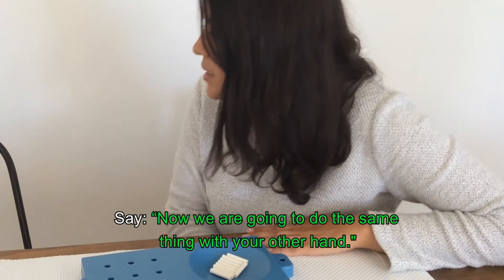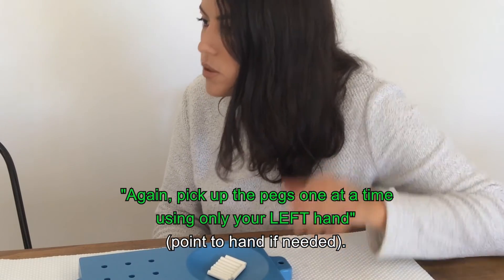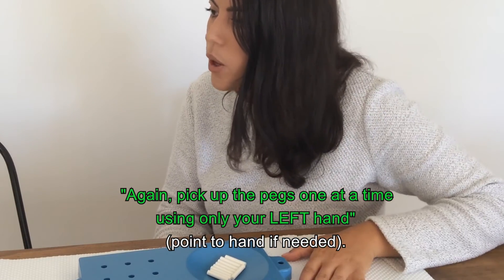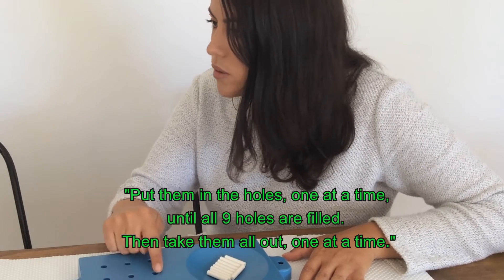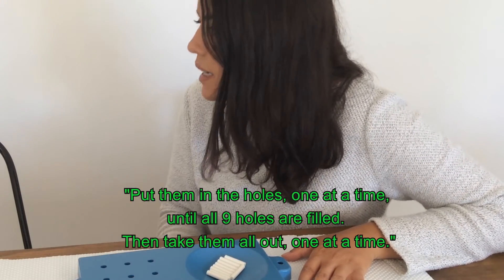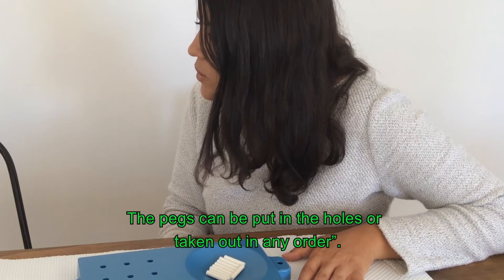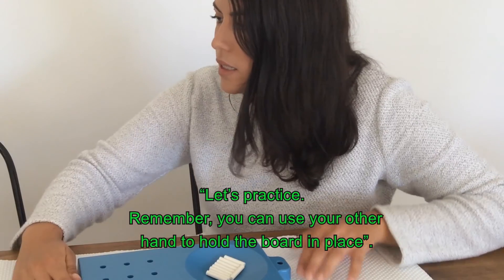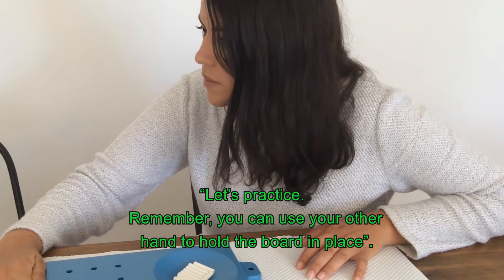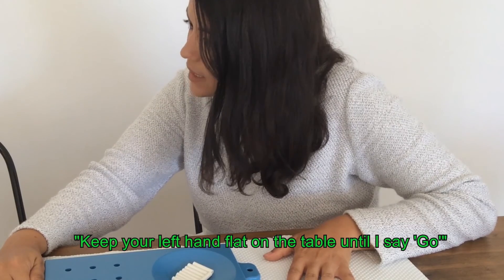Now we're going to do the same thing with your other hand. Pick up the pegs one at a time using your left hand only. Put them in the holes one at a time until all nine holes are filled. And then take them all out one at a time. The pegs can be put in the holes or taken out in any order. Let's practice. Remember, you can use your other hand to hold the board in place. And you keep your left hand on the table until I say go.